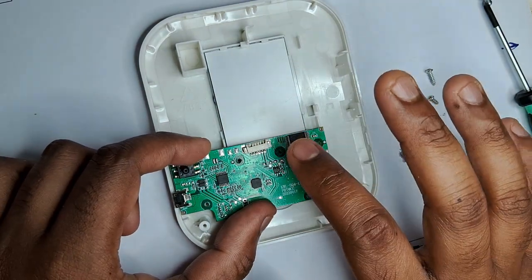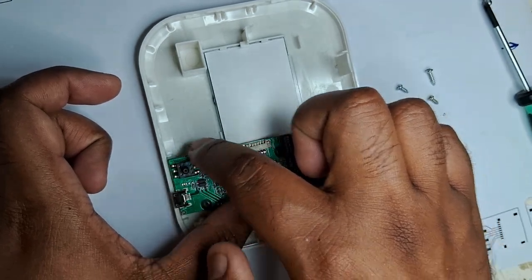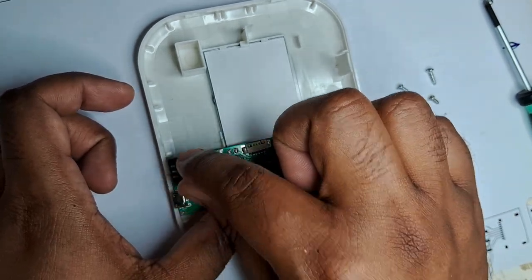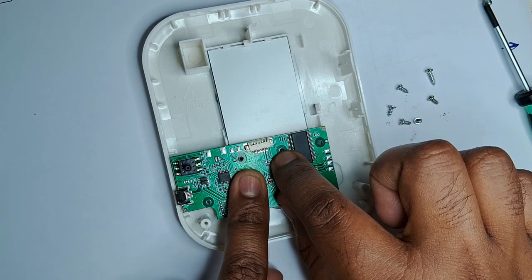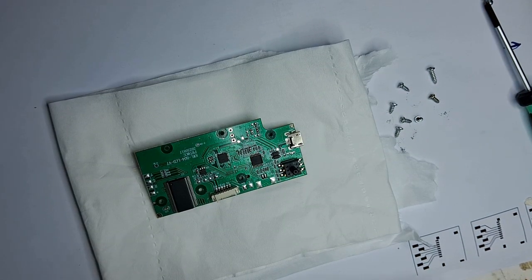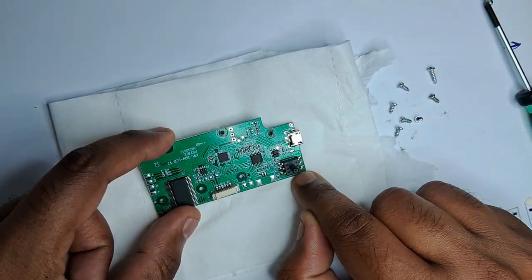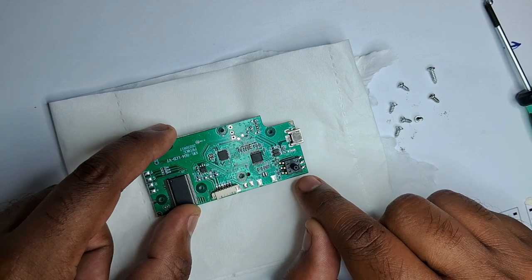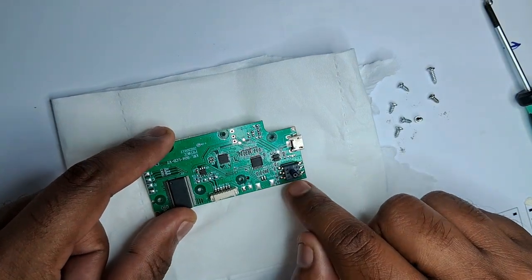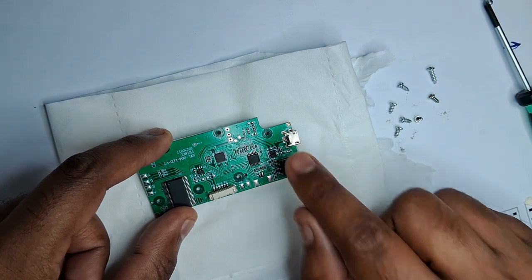So now we will desolder this pressure sensor and try to understand what its specifications are. I have made an arrangement to desolder this, and we will see what specification is written over it, or we will try to find which company produces this and what its part number is.